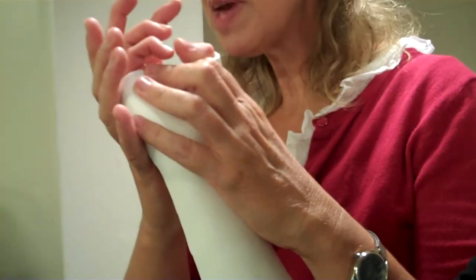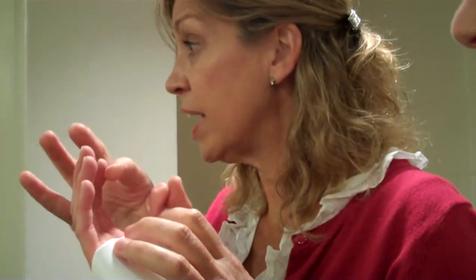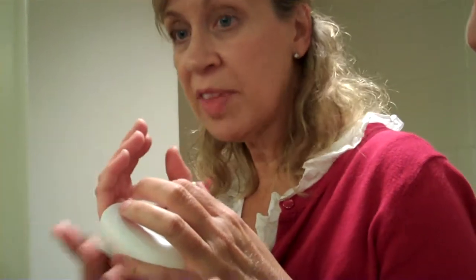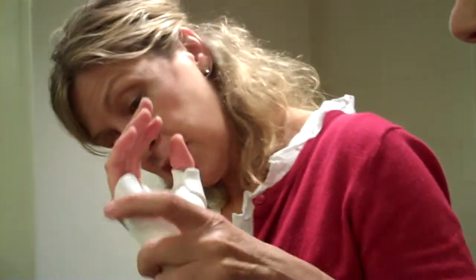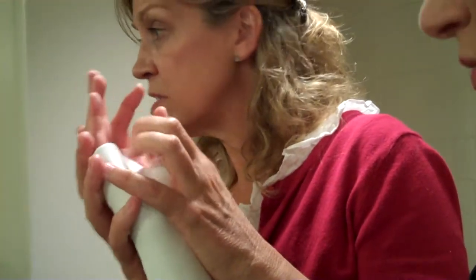And it kind of depends on the patient. His grip, he may have to grip things that are wide, or it may just be somebody who does small things. So take that into consideration. You can always have them try the opposition wide too, to see where it's at.